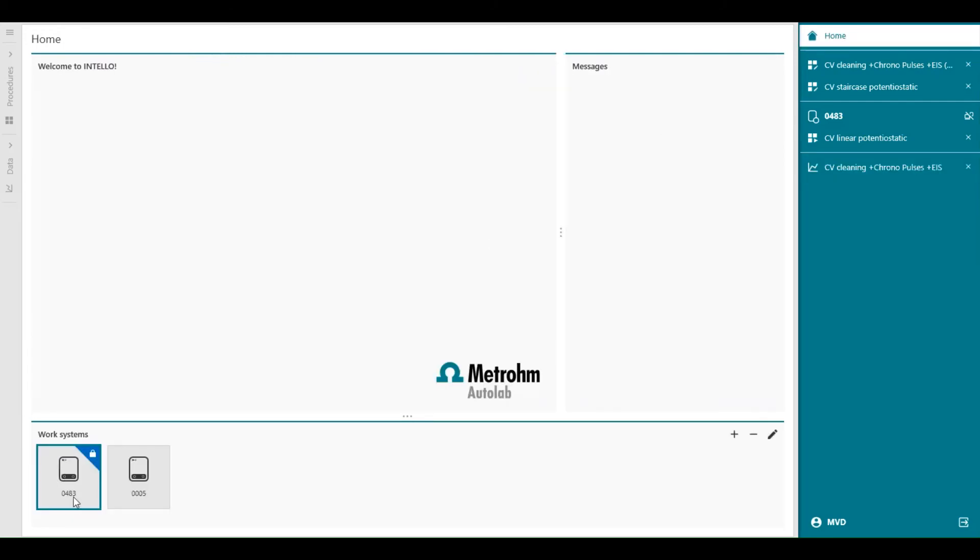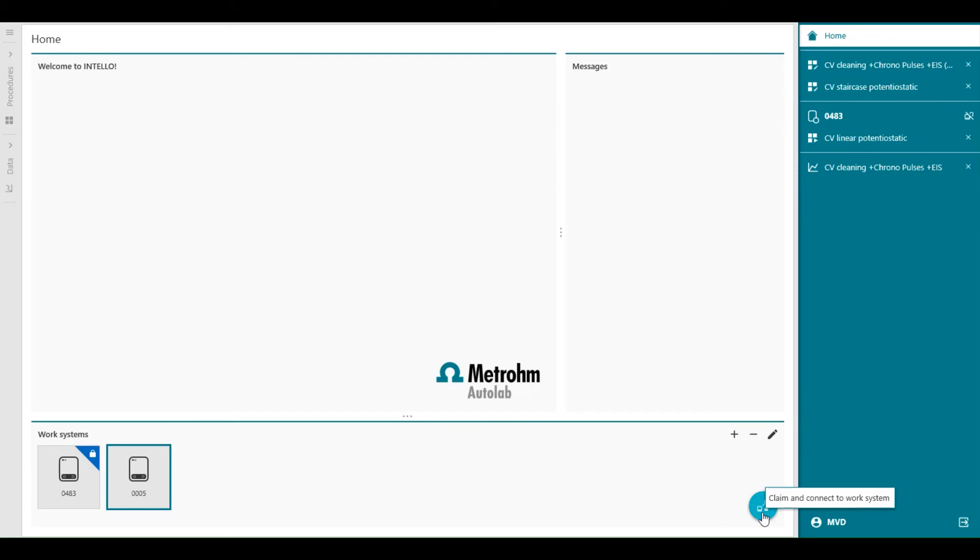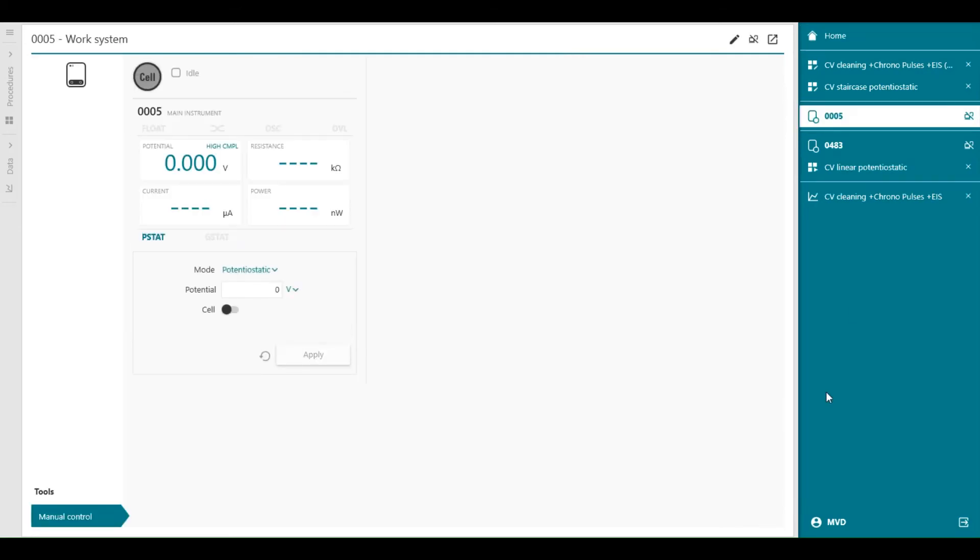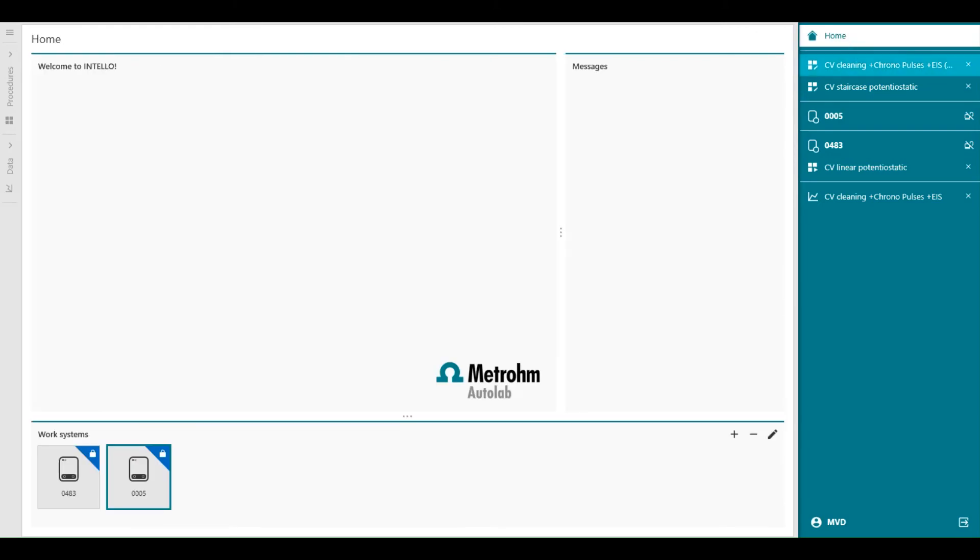The 483 is already claimed, and the 005 is available. Let's claim this one as well. Claim and connect to the work system. You see that 005 becomes available. It shows me the manual control screen.